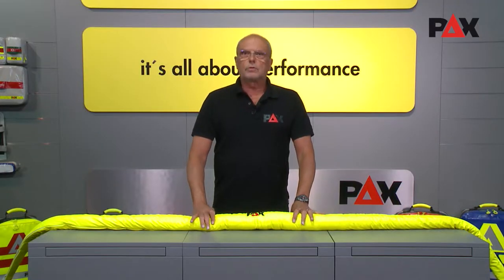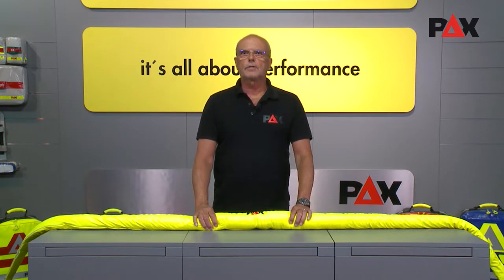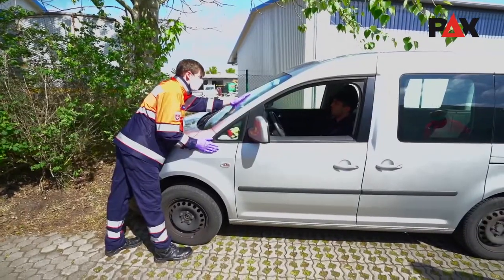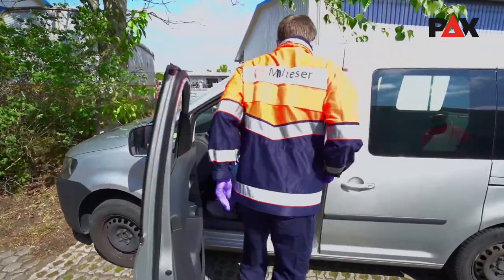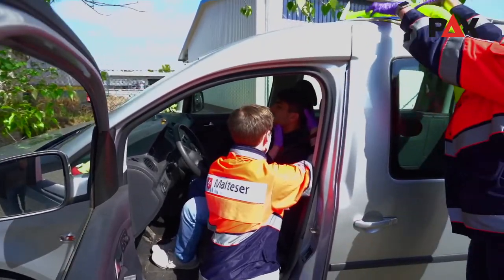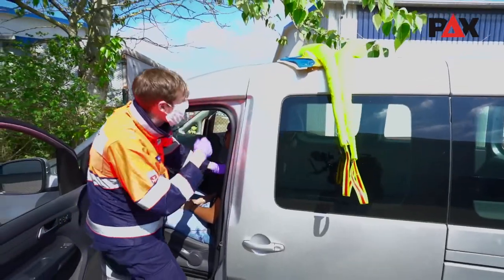To see how such an evacuation takes place, we made a video with two scenarios. In the first scenario, one of the two rescuers ideally approaches from the front and tells the driver not to move. Then he opens the door and fixes the patient's head. Only now can the second person on the opposite side get in, unfasten the seat belt, and take over the fixation of the head.